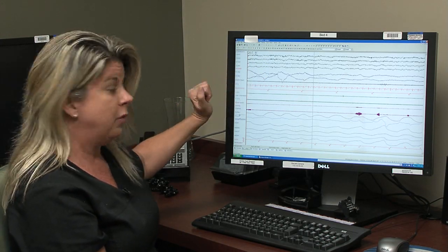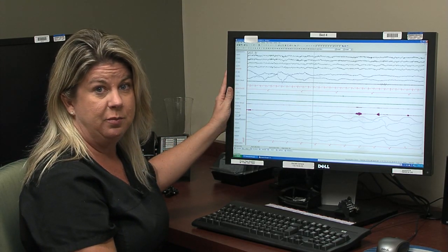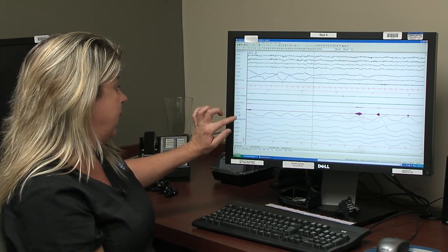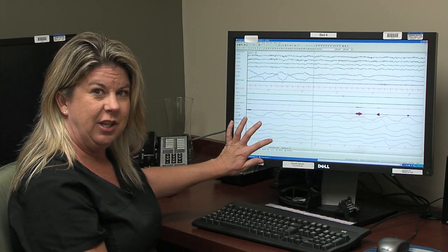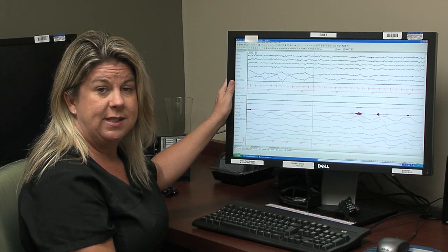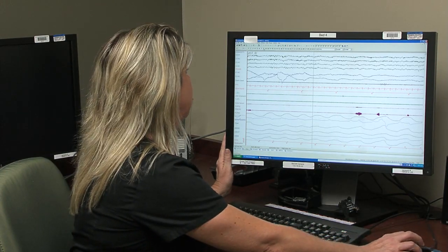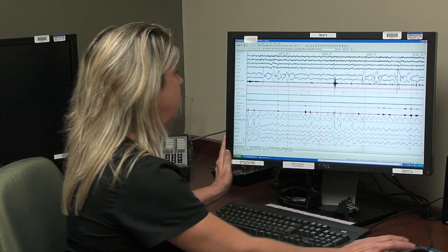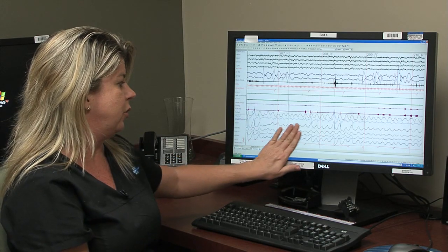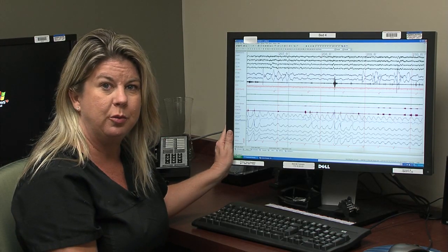We have an EKG and a heart rate channel. We also have leg movement channels, so if the patient has myoclonus or periodic leg movements. We have a snoring sensor that indicates any snoring sounds the patient makes, and we also have airflow, chest effort, and oxygen level. We go through each screen 30 seconds at a time when scoring the record and tell the computer what stage of sleep or if the patient's awake. We then compress the data to a 2-minute screen, and we draw events around any of the snoring, EKG irregularities, leg movements, or respiratory events. The computer then generates a report for the physician to interpret and diagnose the patient with the appropriate disorder.